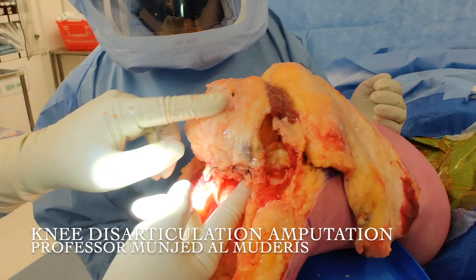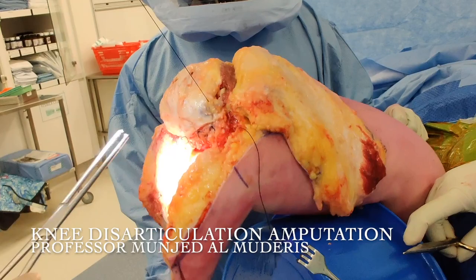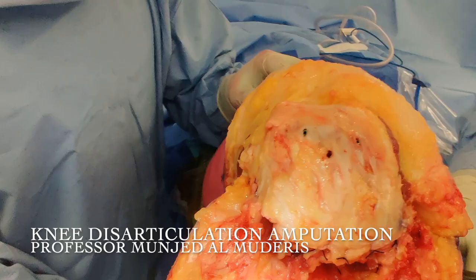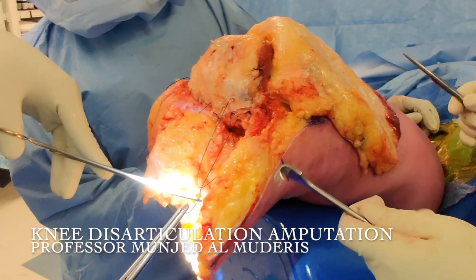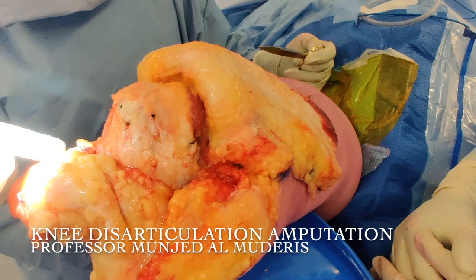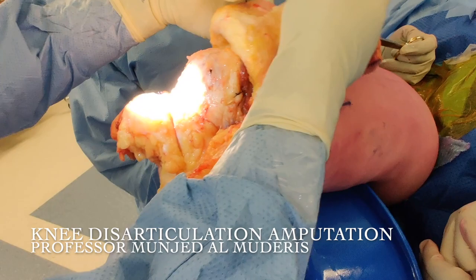You can see the flexor connected to the extensor. Then we proceed to close the medial side. Medial side of the wound is closed and we go back to the posterior side. We finish the posterior side of the wound. Lateral side of the wound is complete. Medial side of the wound is complete. The joint, or whatever is left of it, is sealed. The patella is stable, and now all we need to do is to finish the flap.